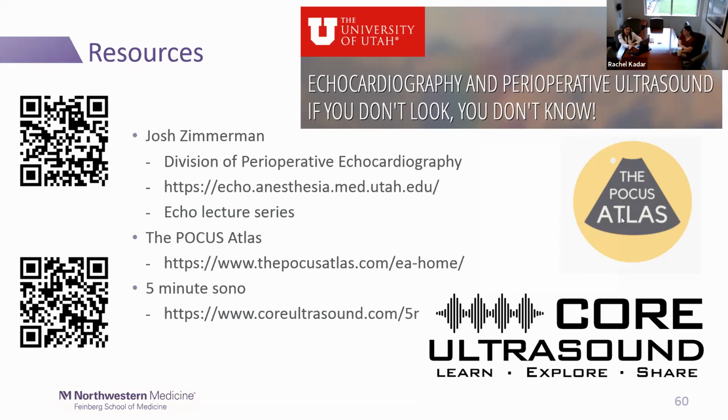In the subxiphoid view, I teach them to rotate to get that short axis view so you can look more at function, and give them some tips on how to look at the right ventricle. I might not be able to evaluate the right ventricle like I would in an apical 4 chamber, but I can still hopefully gather some information that either takes it off my differential or puts it higher on my differential.